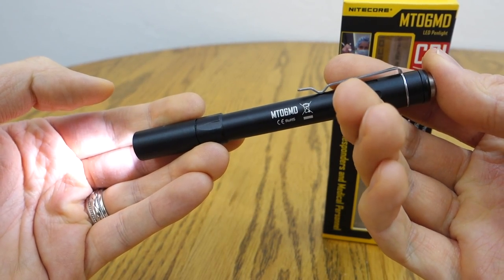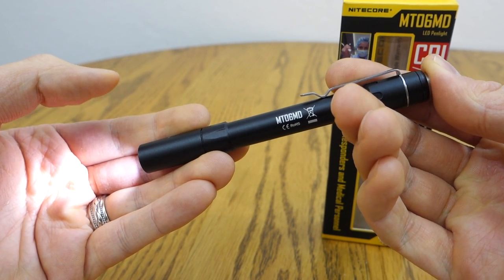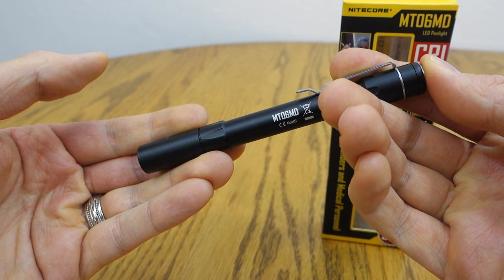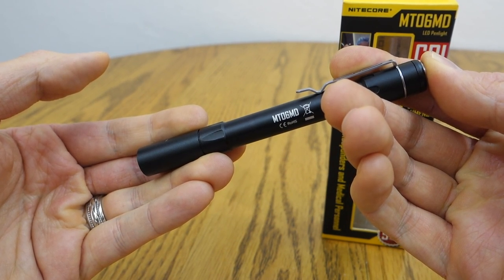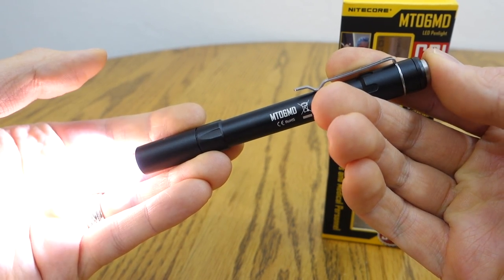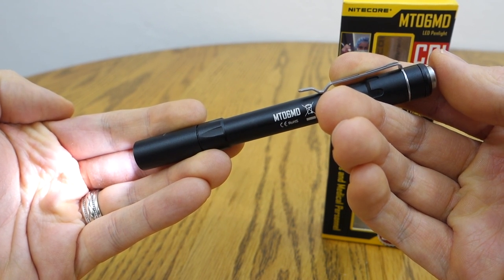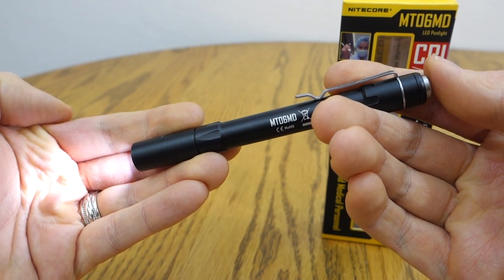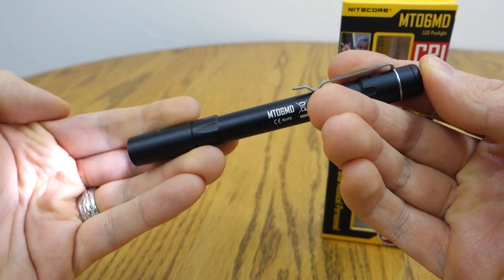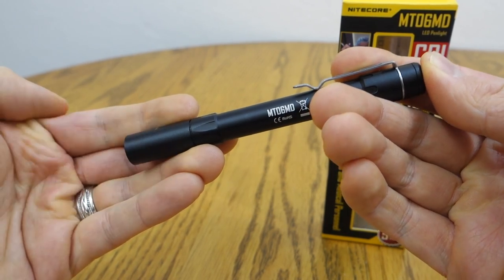There also seems to be something a little goofy with my light. I don't know if this is the same with all units, but if you cycle through and hold down the cap to wait for the next mode, and if you wait the right amount of time — did you see that? It'll flash bright before it goes back down to low. So it's best to just tap the button quickly and it'll go through normally.